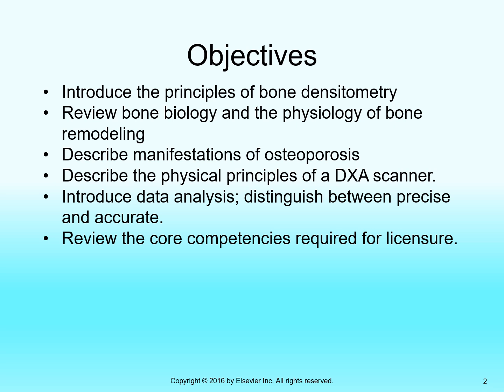Typically the way bone densitometry works is you do many studies on the same patient, every 6 months or every year, and you track progression or regression of calcium levels in the same anatomy and compare, like L3 bony calcium score.